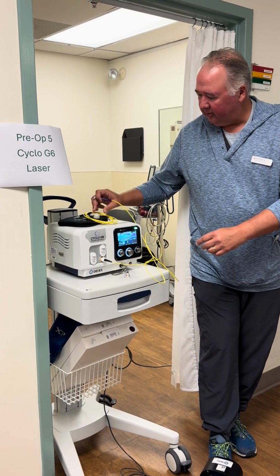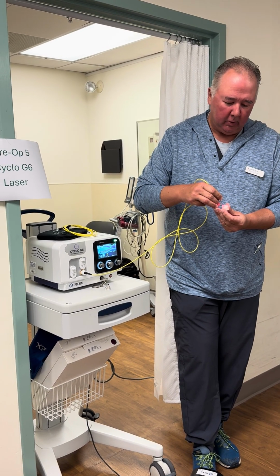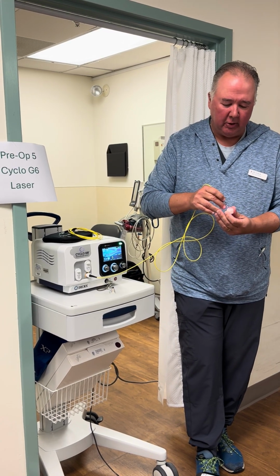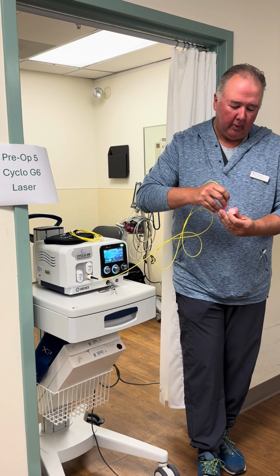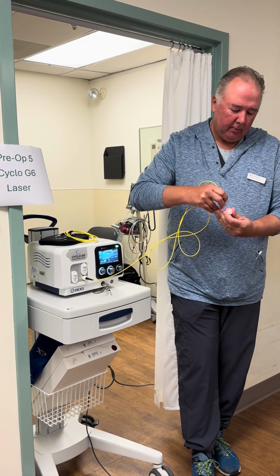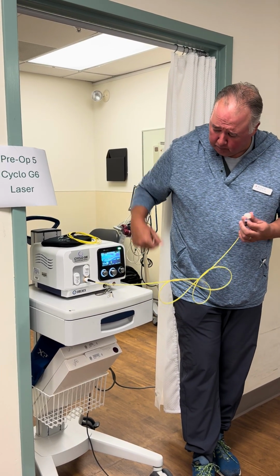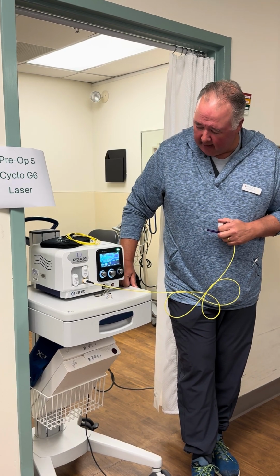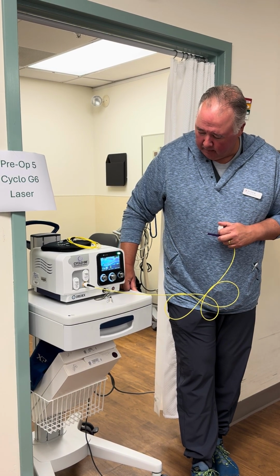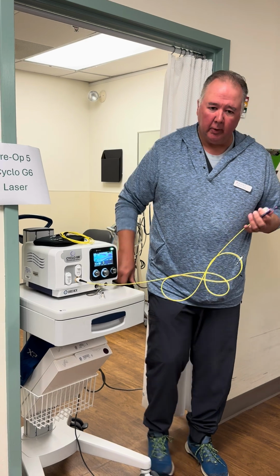So they're essentially going to do the foot pedal, and during this time they're essentially doing that quadrant sweep. So they're going back and forth, and the slower the better. So every 10 seconds they should be changing direction. So they should be coming back, and then back the other direction. And then once this gets to the end of the treatment, that's essentially one quadrant of the eye.